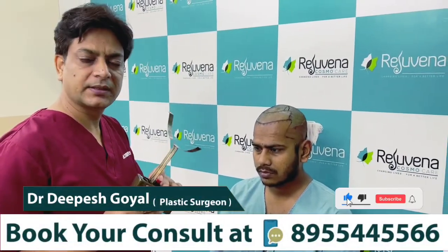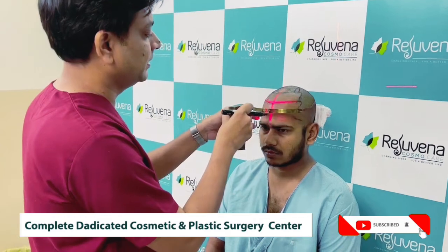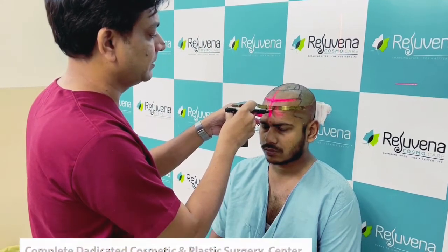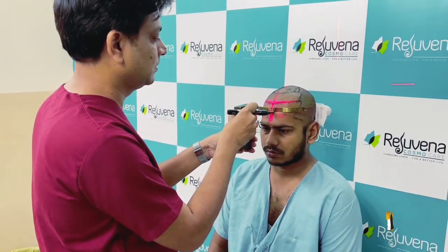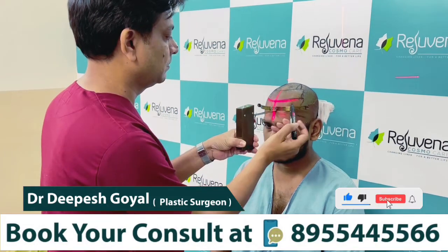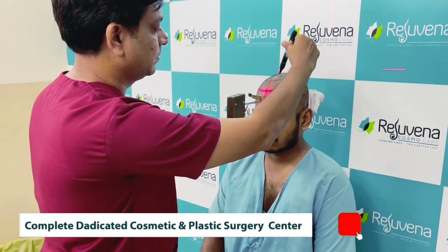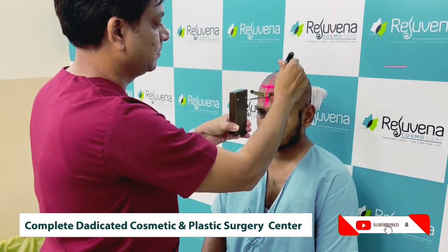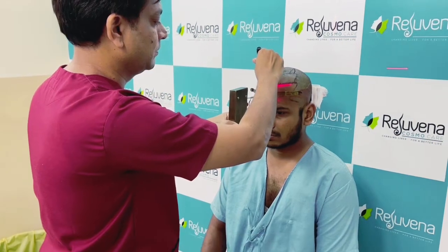So this is our hair transplant marking device. So we will mark the hairline, symmetrical hairline. So this is our midpoint. From there, here we will take a 7 centimeter part, and natural. We will follow the natural hairline. So you can see here. This is our final line.